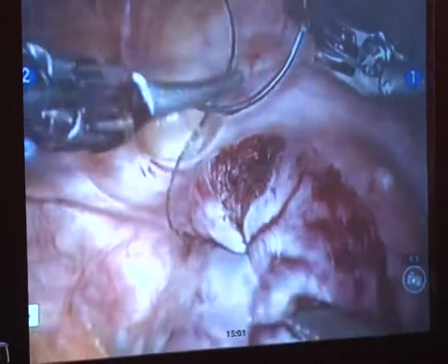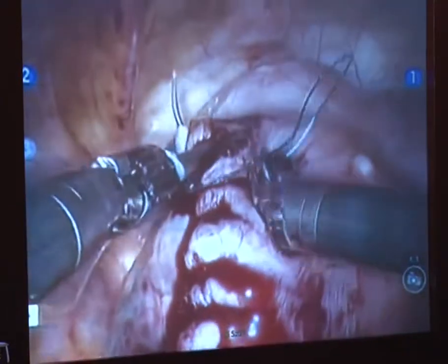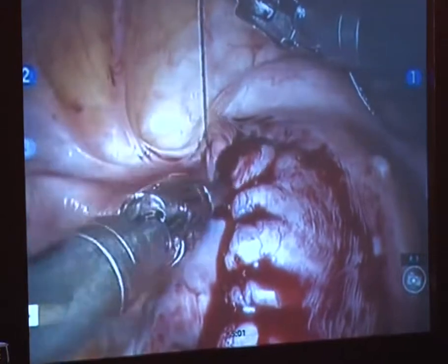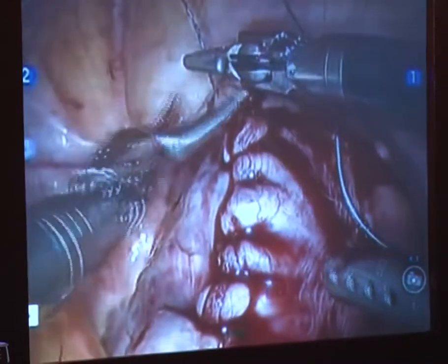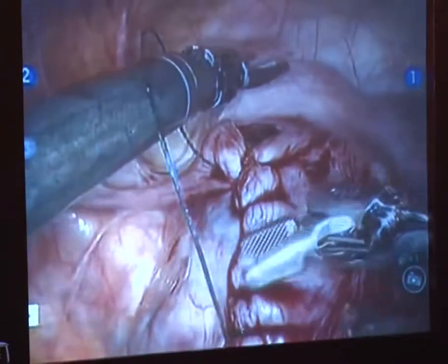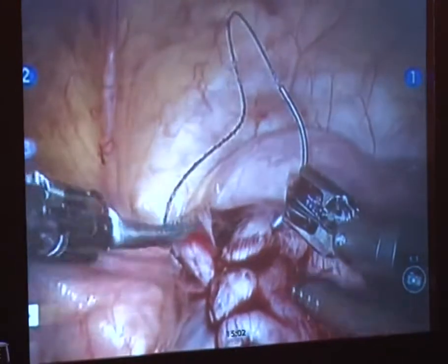Dr. Anna, is it mandatory that we use an adhesive barrier? Because we did one myomectomy recently, Dr. Nina Desai's, and knowingly or unknowingly, I just sutured it with this barb and left it bare. Of course, we didn't have any problem, but is it mandatory if the patient is fine? It's mainly for the adhesions. Yeah, ma'am. How often do we get adhesions or bowel adhesions? Don't suction too much because I'm losing my pneumo. Luckily, we didn't. Patient went through.